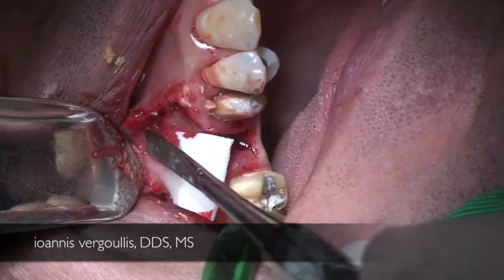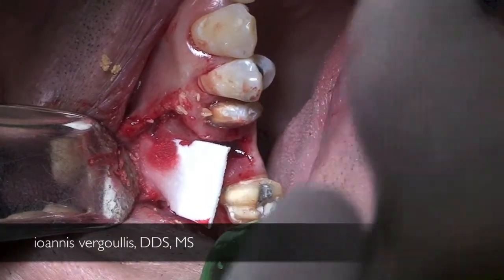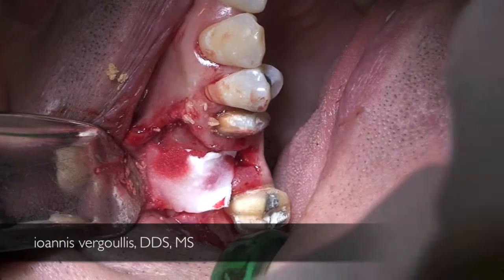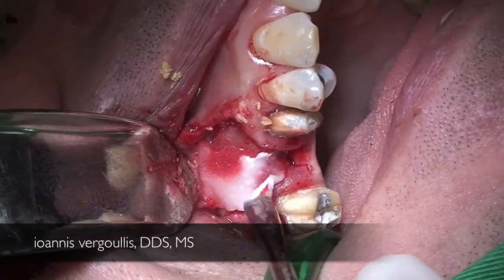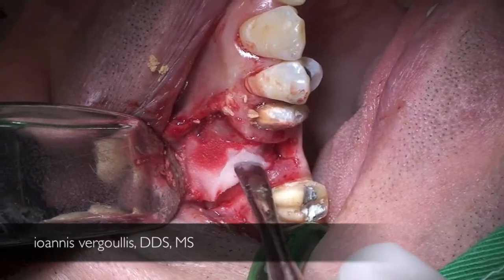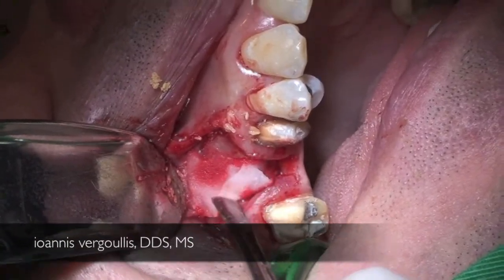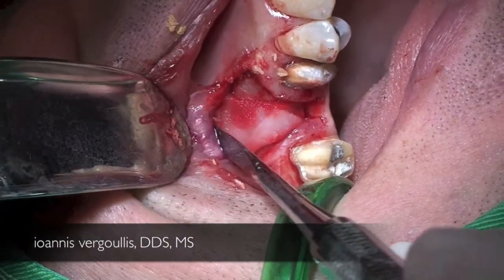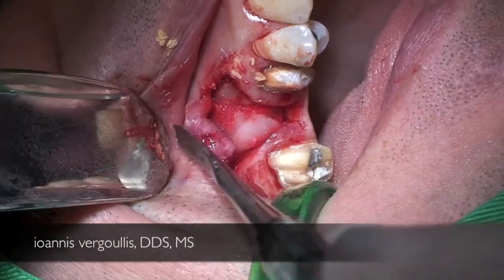After completing the bone graft placement, we cover the window with the collagen membrane and then proceed with flap replacement and suture.